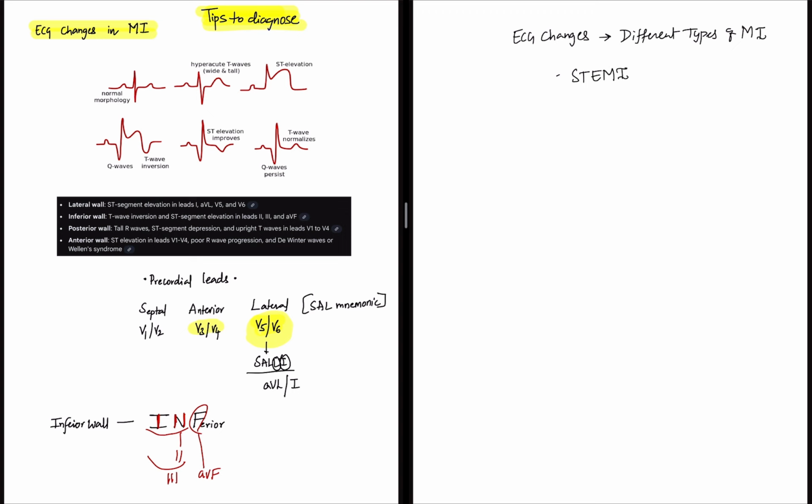That means the characteristic finding what you see in an ECG is, if this is P wave, then you have a QRS complex and this is an ST segment, right? Starting from S wave, you have T wave. This ST segment usually shows elevation.